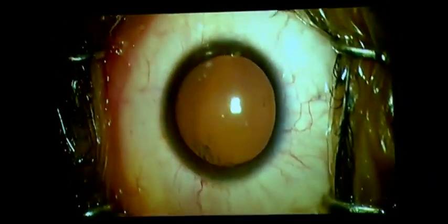Just rotate your cartridge in one way. Just try to push and see if the lens is freely mobile, because the Helon is coming out. This is the first time we use Helon for a lens loading. Put it into the bottle, inside the bottle. The lens has to be put inside the bottle again, it should not get dehydrated.